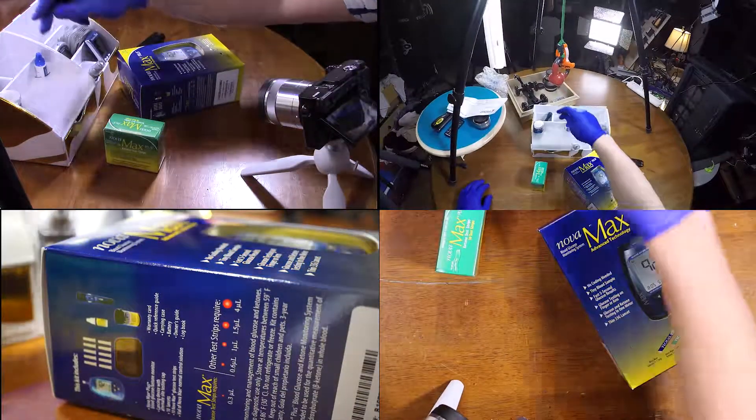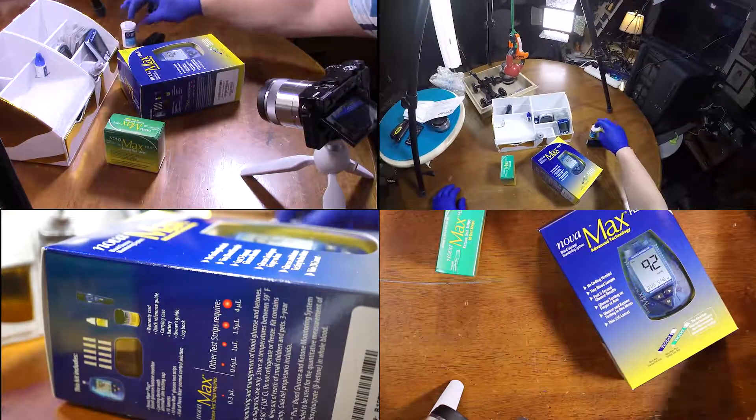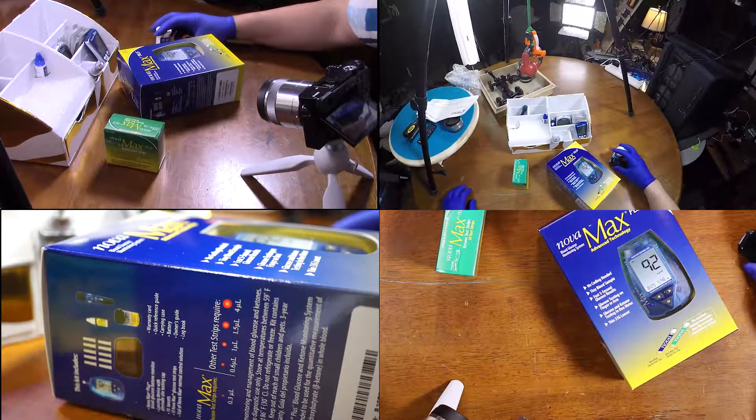We'll put these to the side, although I don't have my strips over here. These are all that I do have — those strips. So we can do a comparison on these.